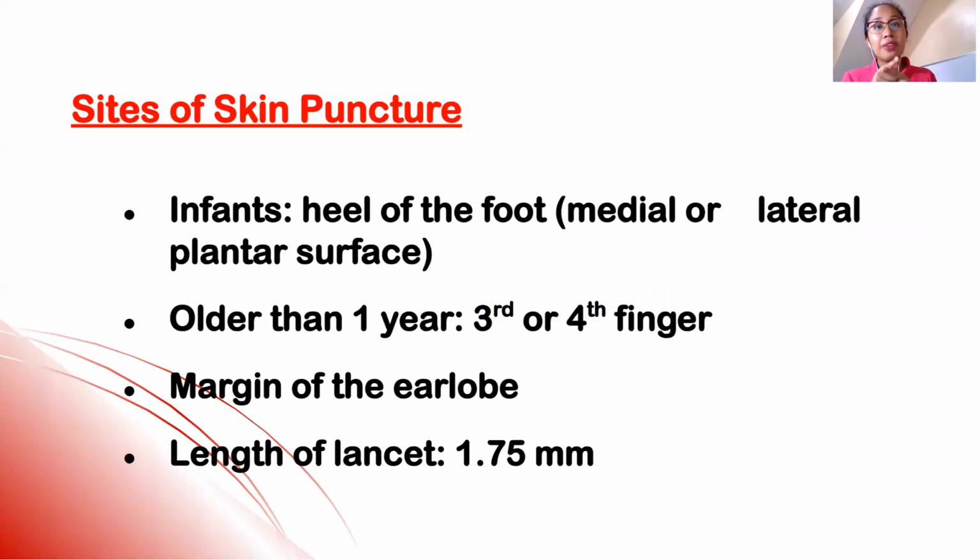Sites of skin puncture. So, when it's an infant, we puncture the heel of the foot. Because if we use fingers, guys, we might hurt the bones of the baby. Kaya sa heel of the foot, in the medial or lateral plantar surface. Mas maganda lateral. And for older than 1 year old na class, medyo kasi naglalakad na, we could now use the third or fourth finger at least. We won't hurt the bone anymore.